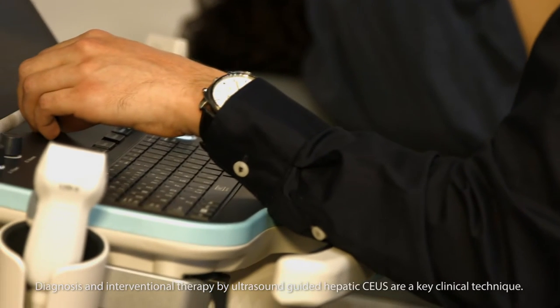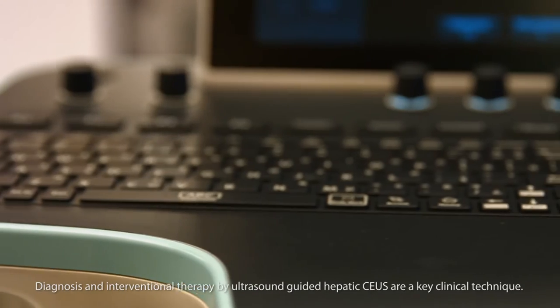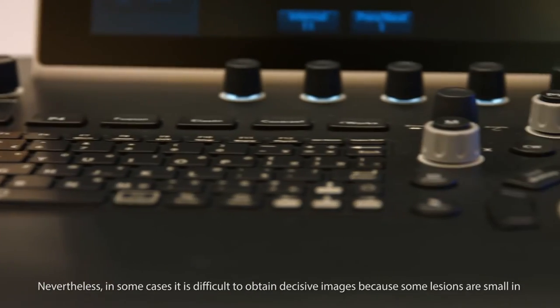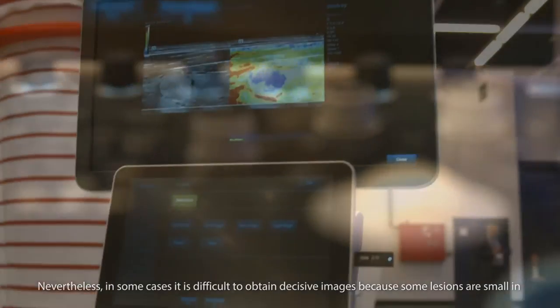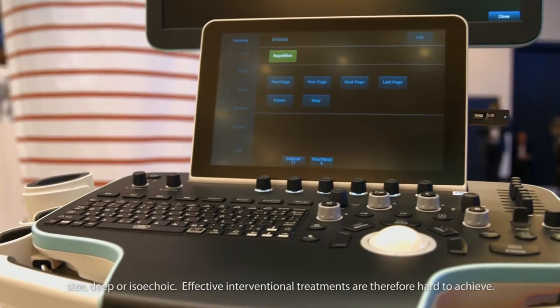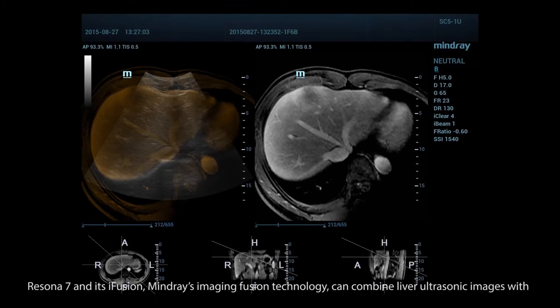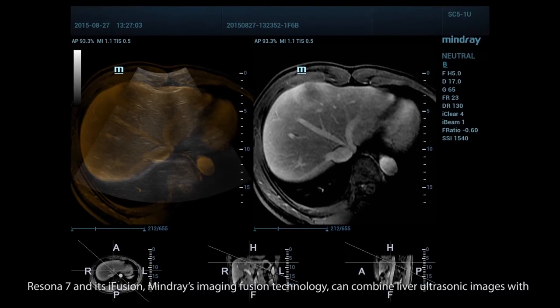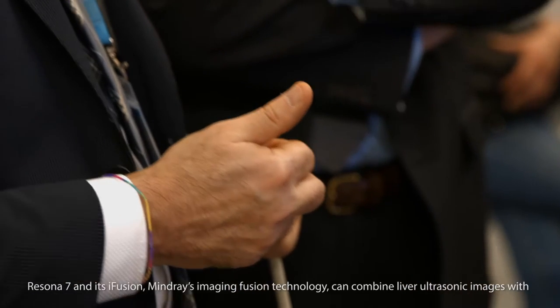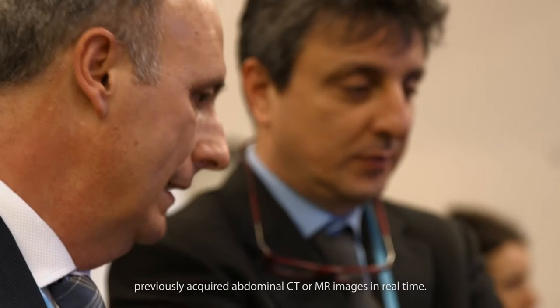Diagnosis and interventional therapy by ultrasound-guided hepatic contrast-enhanced ultrasound are a key clinical technique. Nevertheless, in some cases it is difficult to obtain decisive images because some lesions are small in size, deep, or isoechoic, making effective interventional treatments hard to achieve. Resona 7 and its iFusion — Mindray's imaging fusion technology — can combine liver ultrasonic images with previously acquired abdominal CT or MR images in real time.